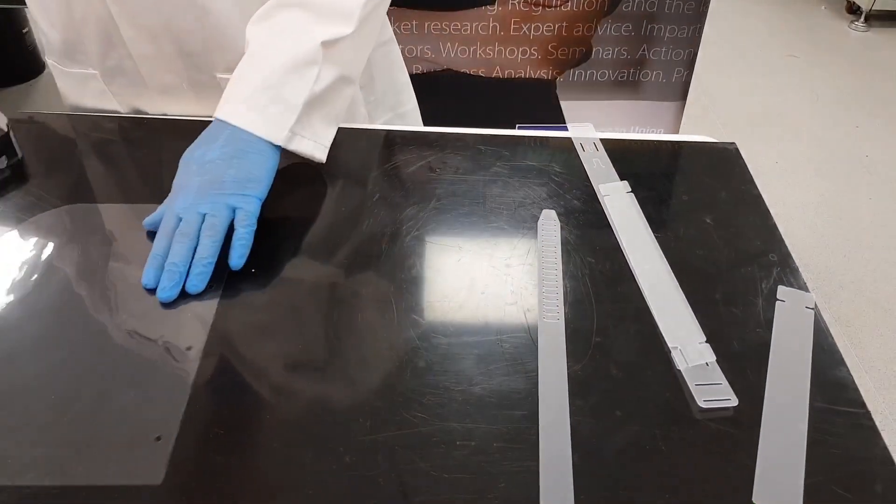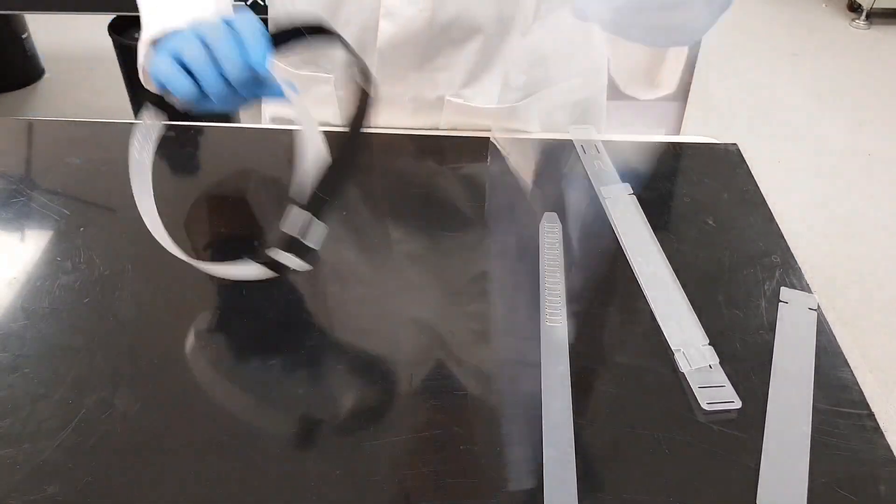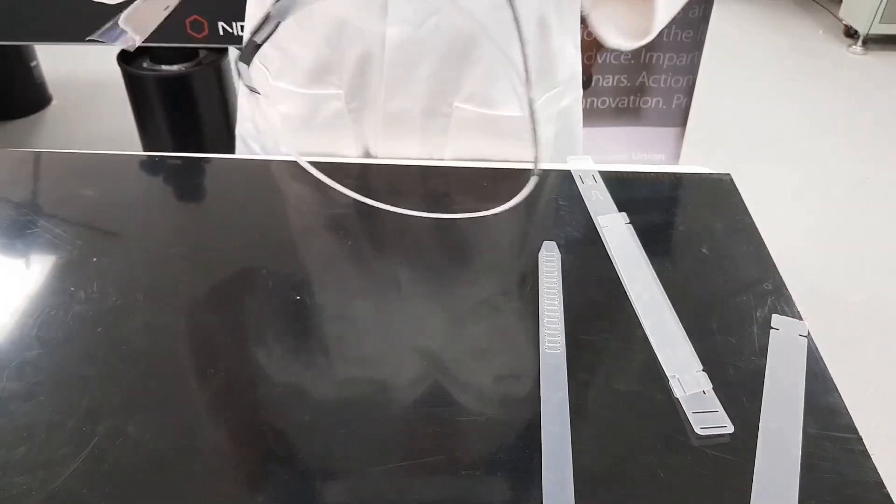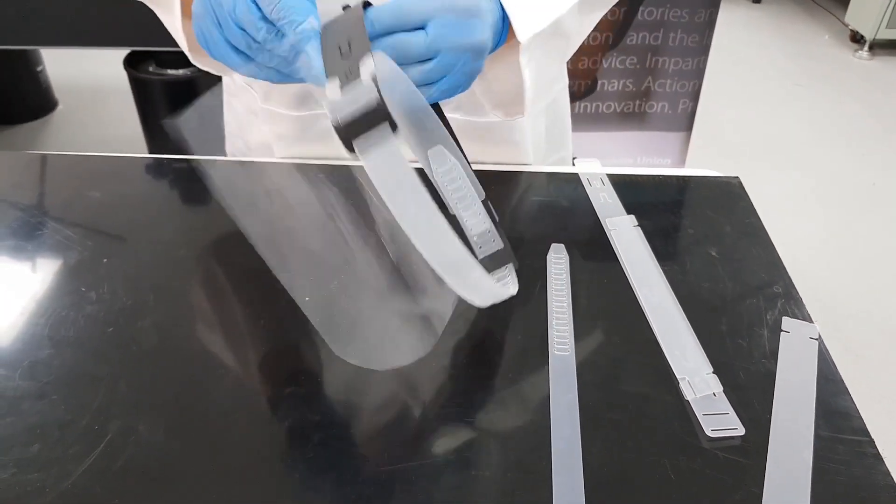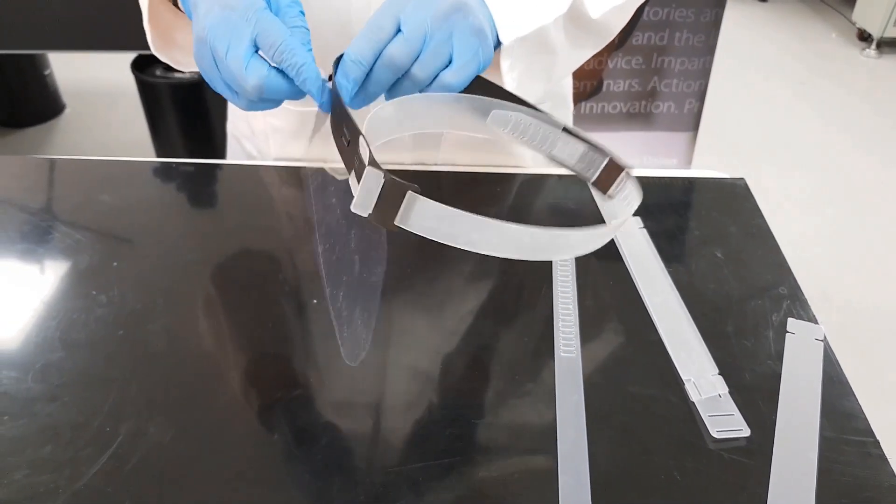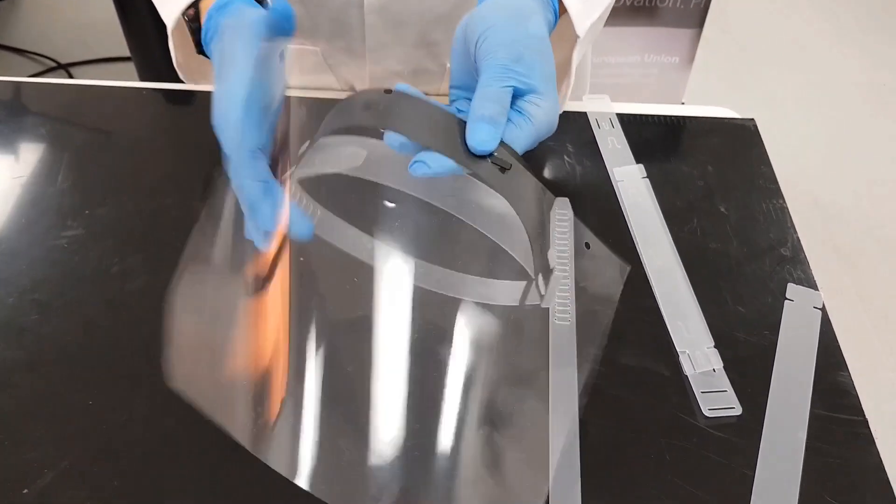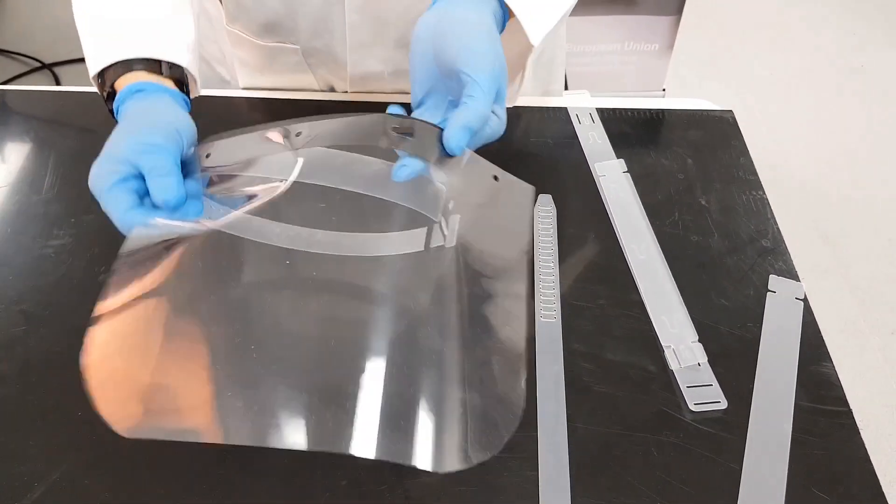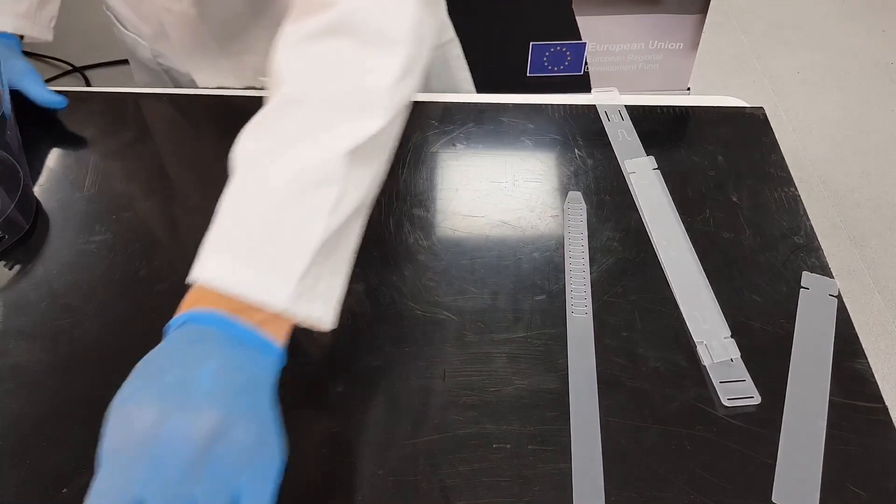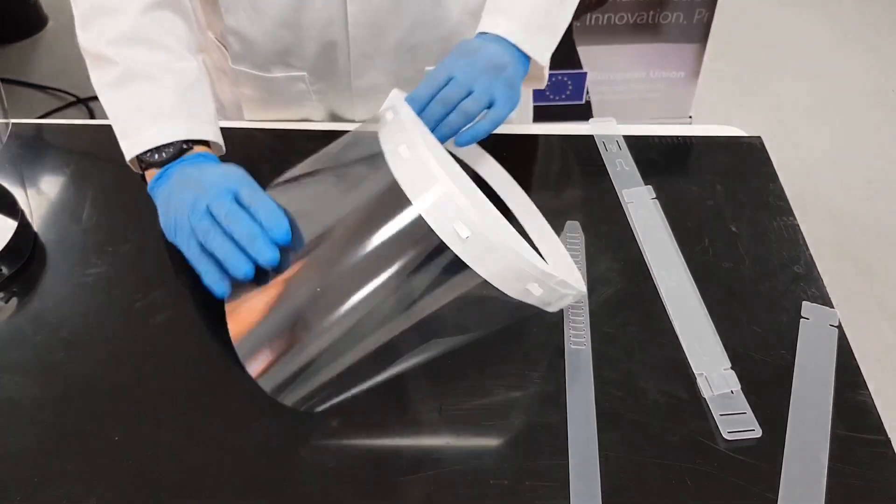After that, we take the acetate, starting from the middle, and feed it through the punched holes like so. We feed that through all four holes on the headband to give us the finished visor.